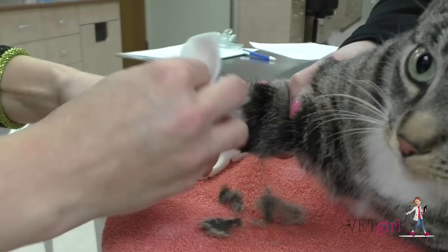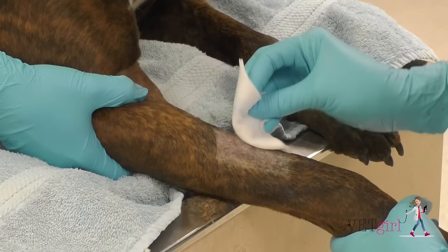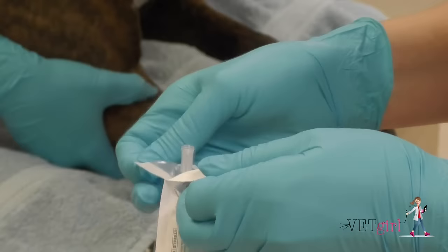You can also consider using a topical EMLA, like a lidocaine cream, if time allows. Gently scrub the catheter site, similar to surgical scrub preparation, starting from the center of the site and moving out to the periphery while scrubbing. Once this has been done, use non-sterile gloves for catheter placement.